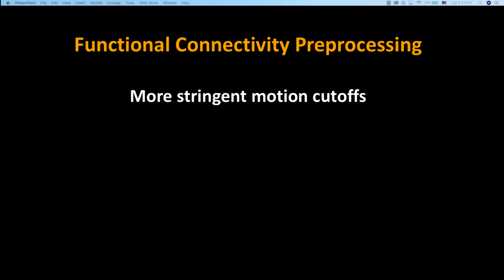The same idea happens with pre-processing. So instead of these 2-dimensional images that we take with, say, a phone, we have these 3-dimensional images that are being reconstructed from this MRI machine. But we have the same problem. If I were to be moving while somebody took a picture of me, it would look blurry, right? And it's the same thing if somebody moves a lot when they're in the scanner. The picture looks blurry. It needs to be relatively stable for it to be a crisp, clear image. And we do a few other things. We do normalization. I'll be going over those in a little bit.